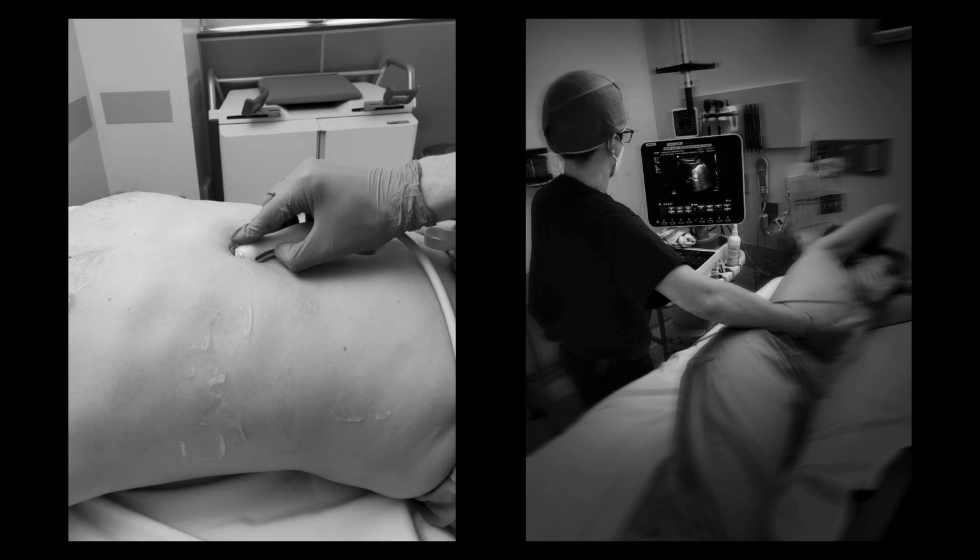Those lungs and the air in the lungs really work to defeat the ability to see with ultrasound. They block the ultrasound and we can't see through them. So you have to find this small little window. Remember that lingula of the left lung? There's a little window there where the heart pericardium approaches the chest wall, and we can get a little bit of a cardiac window in there where we can see underneath and through that lung. So we have to find that small little space.